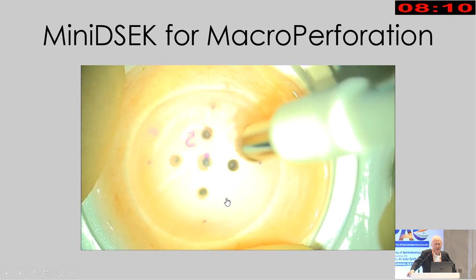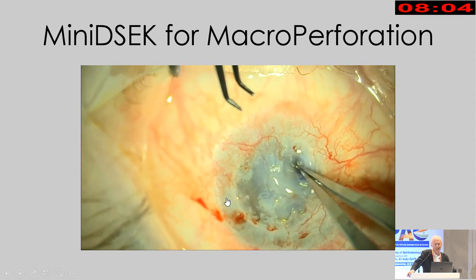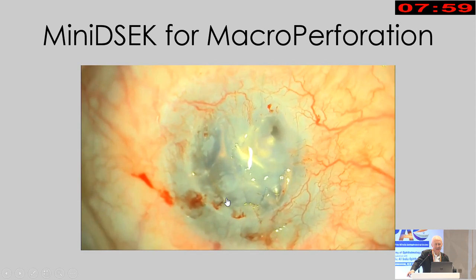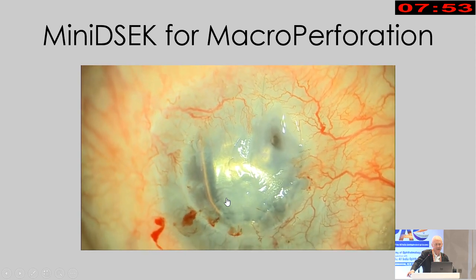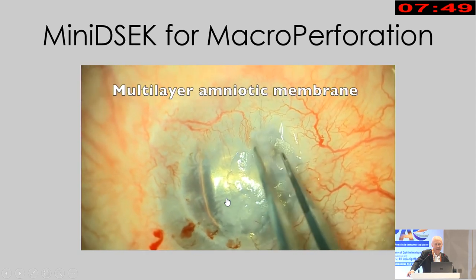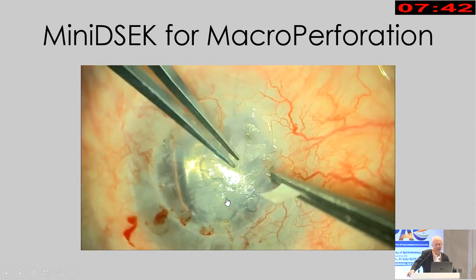And we usually go about 1 millimeter larger than the perforation all round, and then pushing this donor through the perforation there. That's Alfonso's rather nice variation, and a bit of air in the chamber, and then some fibrin glue and some amniotic membrane to layer up there, and then a bit of amniotic membrane over the top, basement membrane down to finish off to encourage epithelialization.